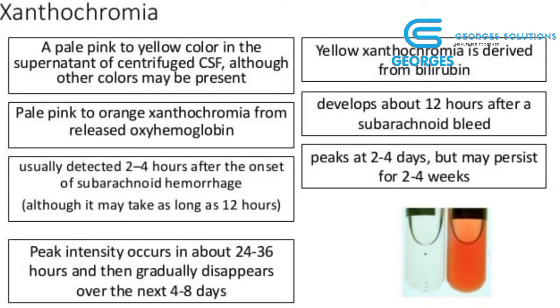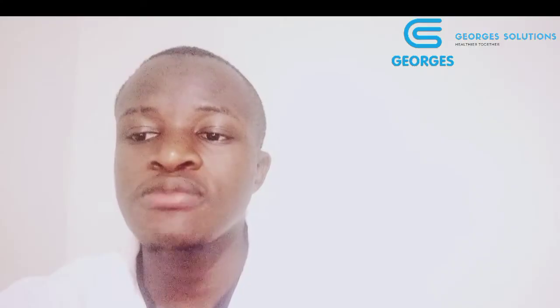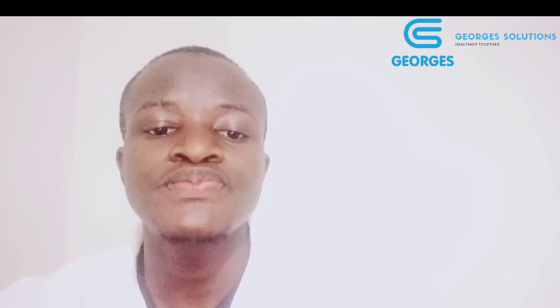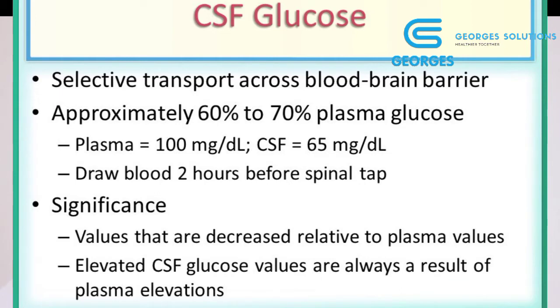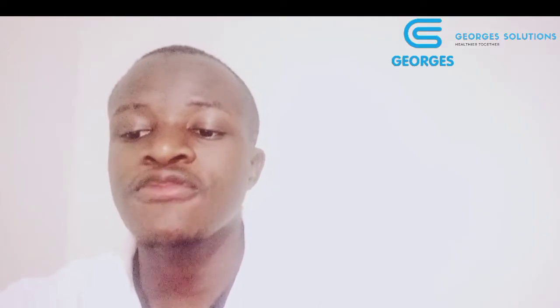It is usually advised to collect sequential specimens into universal containers. So you label 3 28mm sterile white top plain universal containers and 1 gray top fluoride oxalate tube with the patient name, hospital number, ward, date of birth, the time that the CSF was obtained and the sequence of sampling. So collect and transfer 0.5 ml CSF into a gray top vacutainer for glucose and you label it 1. Transfer 2 ml of CSF into each of the 3 sequentially numbered sterile 28mm universal containers labeled 2, 3 and 4 respectively.